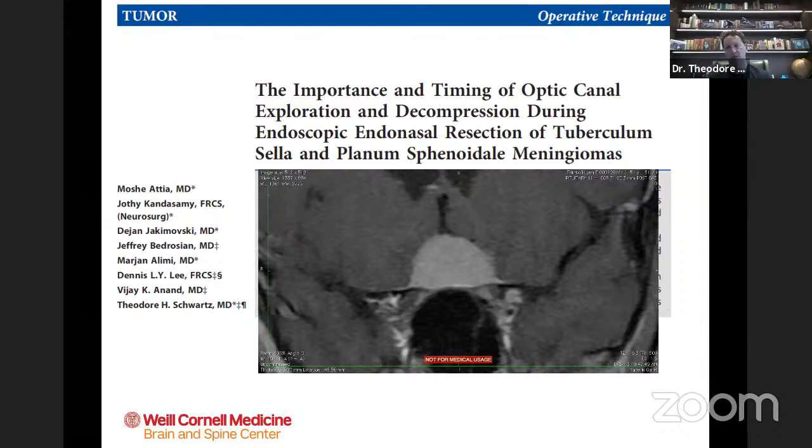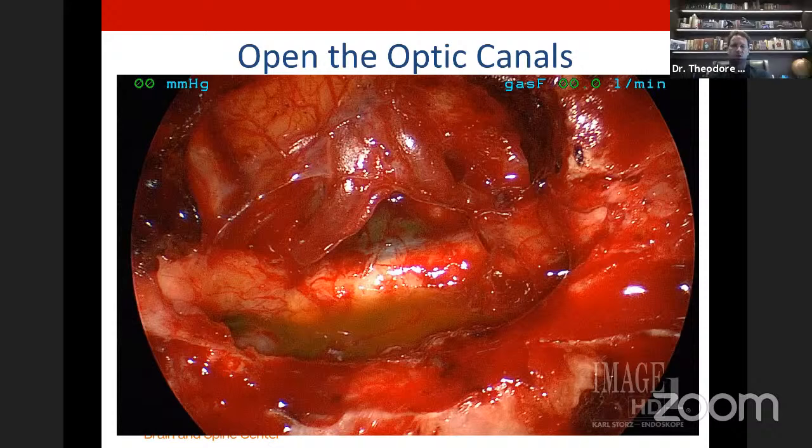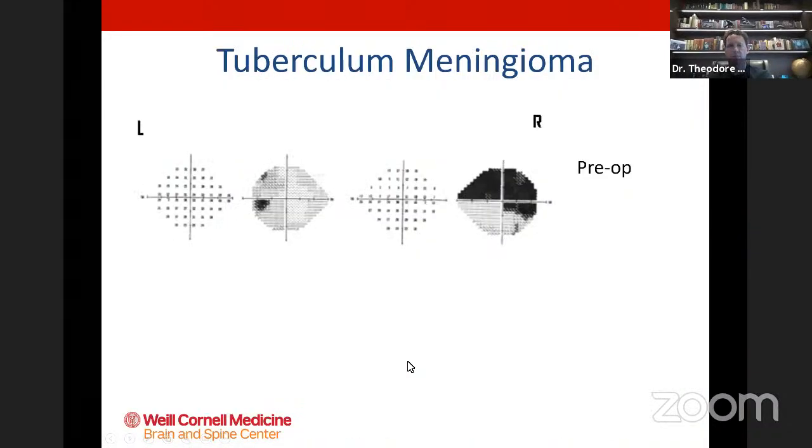So I'm going to talk about the techniques that we use to get out some of these tumors from below. So this is a nice example of a case where someone might say, well, there's a lot of tumor in the medial optic canal, you shouldn't do this from below, or there's some tumor extending laterally. And the truth is, there's no question that that medial optic canal has got to be opened up if you want to take these tumors out. So after doing a surgery like this, this is the view you get. You have to open up the medial optic canals bilaterally. Here you can see the optic chiasm, the lamina terminalis, A1, ACOM, A2, the olfactory nerve, gyrus rectus, all that is available to you. And then the pituitary gland, of course, below.